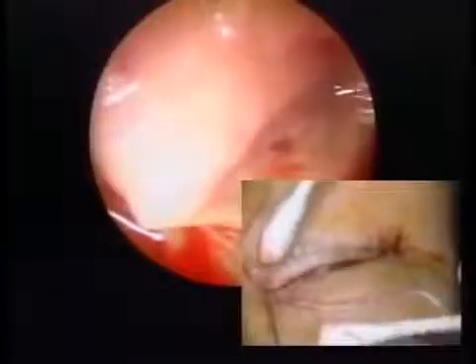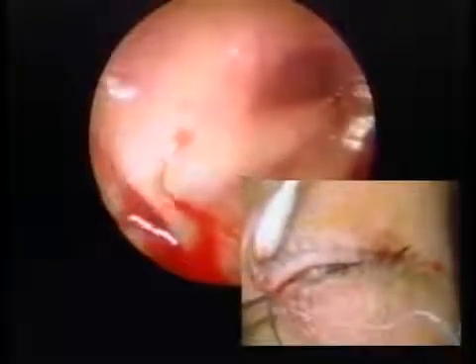The metal probe is drawn further to make a 10 mm portion of the tube flexible, to follow the anatomy of the nasal lacrimal duct. The membranous nasal lacrimal duct on the temporal wall of the inferior nasal meatus is obstructed, and the nunchuck tube is progressively opening it.